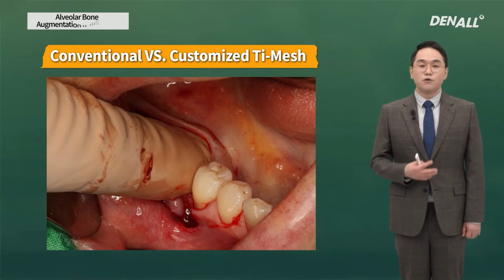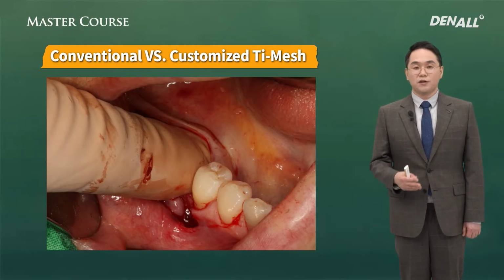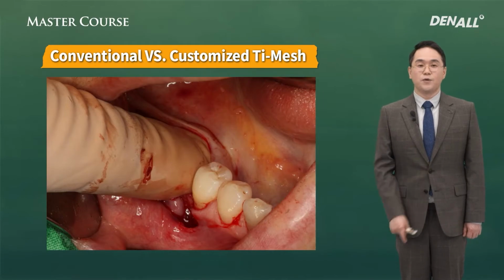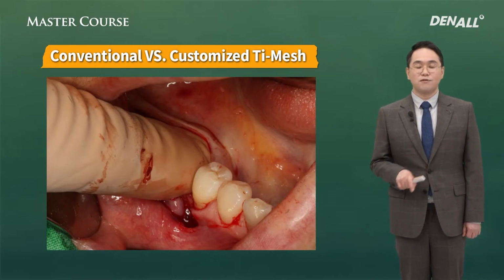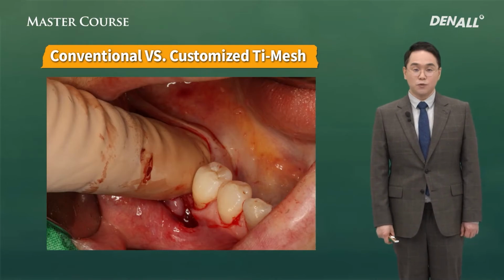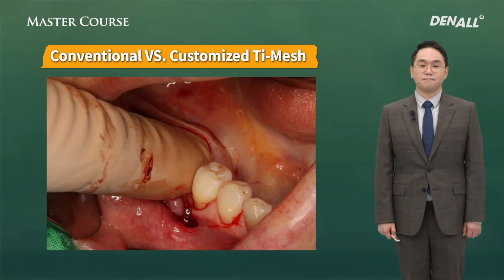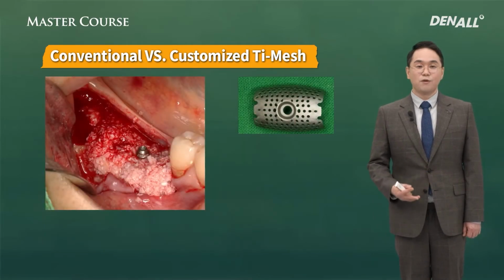That is the benefit. If you use an instrument, sublingual artery or lingual nerve can be damaged. So if you use an index finger to do blunt dissection below the mylohyoid ridge, lingual flap can be advanced.